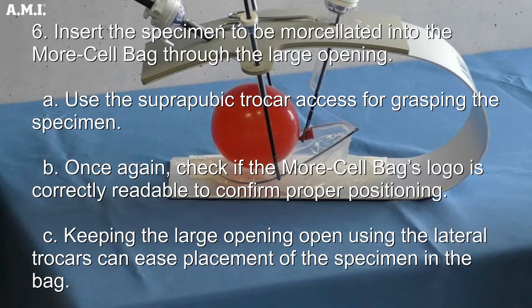Insert the specimen to be morcellated into the More-Cell Bag through the large opening. Use the suprapubic trocar access for grasping the specimen. Check again if the More-Cell Bag's logo is correctly readable to confirm proper positioning. Keeping the large opening open using the lateral trocars can ease placement of the specimen in the bag.